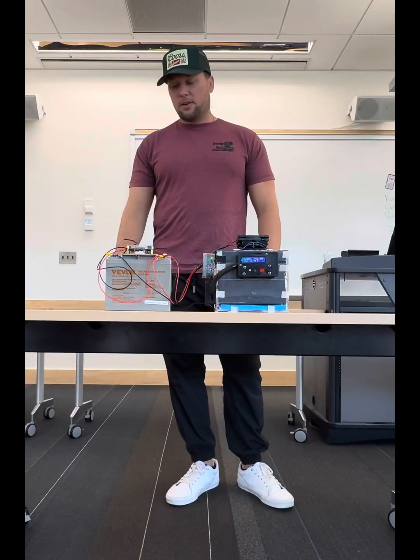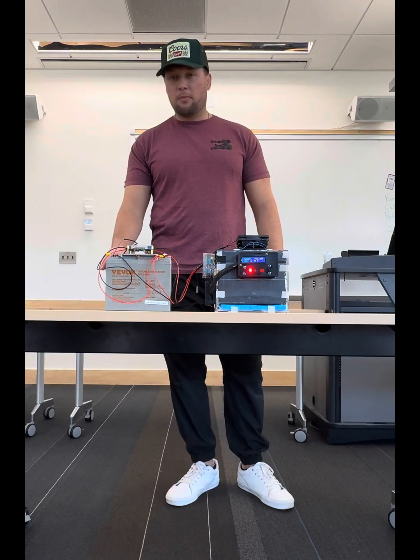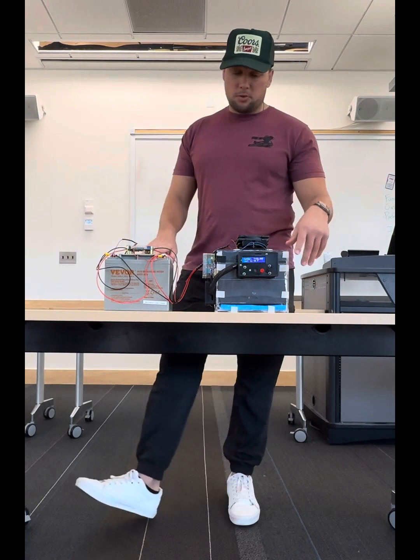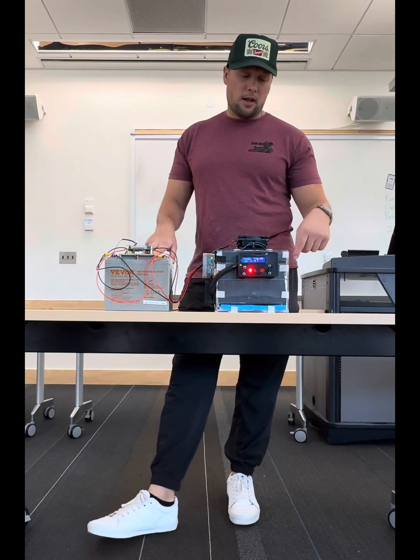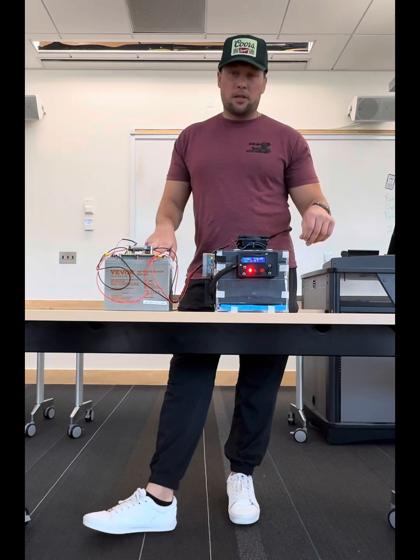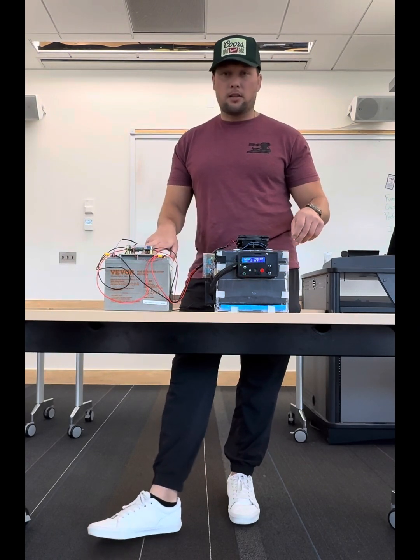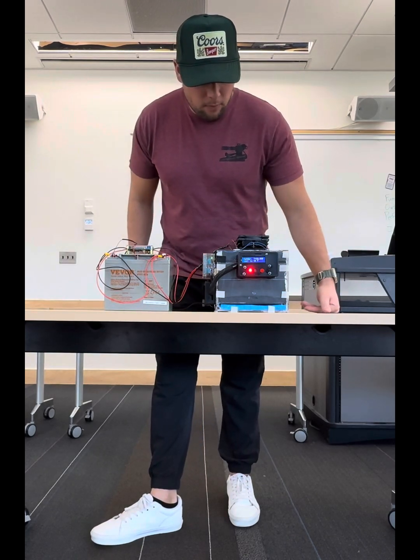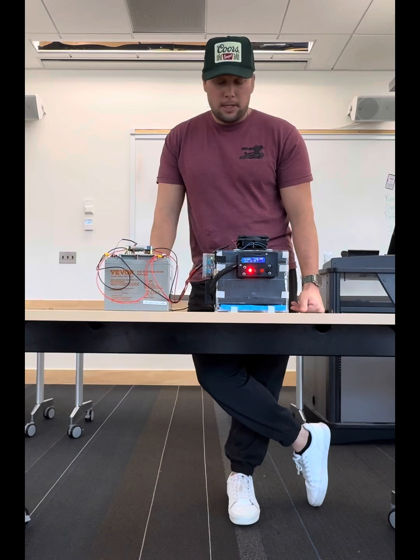All right, to kick us off, we're going to start with our basic structure of our cooler assembly. Over here on my right, I'm going to have the power source attached with a transformer. Coming over to the actual cooler itself, our structure is going to be made of acrylic, as you can see on the outside. That was all cut with a laser cutter to the CAD specifications that will be outlined in the final report. Looking on the front here, we're going to have an LCD box with our basic LCD controls. That's going to actually control the inside of the cooler assembly.